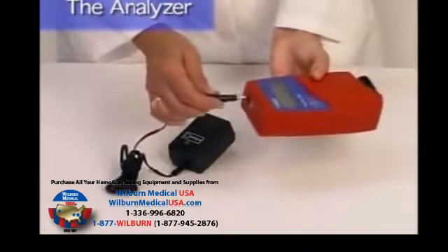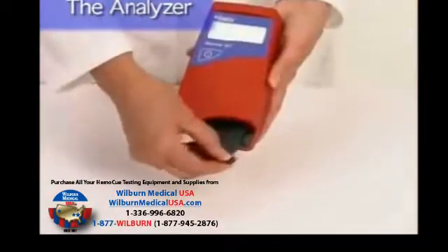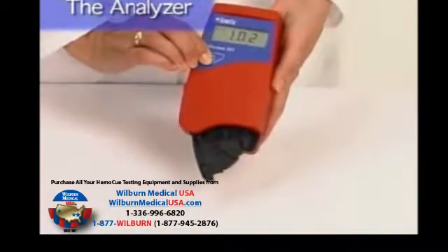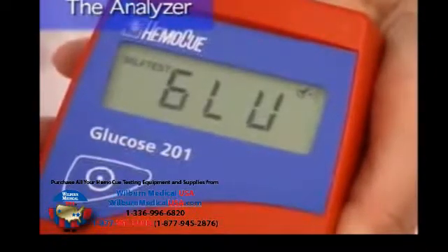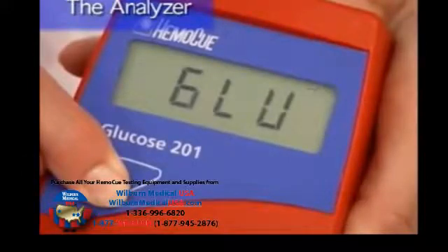First, connect the power adapter to the power inlet and to the main power supply. Next, pull the cuvette holder out into the loading position. Press and hold the on-off button on the front of the analyzer until the display is activated. The words self-test and the version of the program should now be seen on the display. The word GLU will then be displayed.